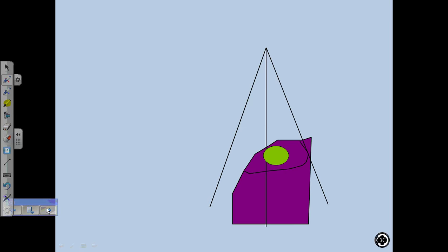So here's an example of a beam coming in, AP beam. This could be a chest, this is like an axial cut of a chest wall. There's a tumor there. And this beam comes in, and this black line is one of the isodose lines, okay, that covers the tumor. So if we put a compensator in the head of the machine, the isodose line becomes more uniform. So we're able to reduce treating this area right here.